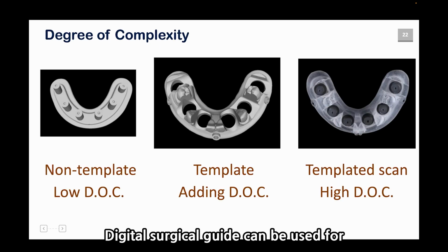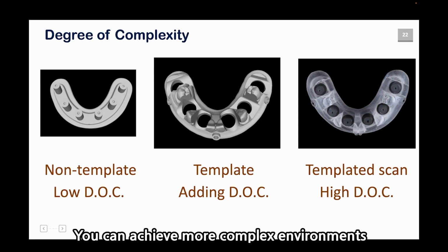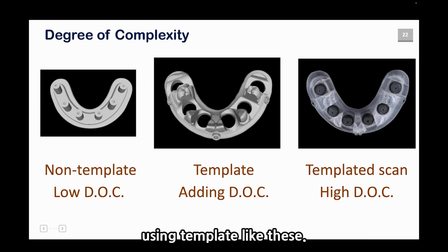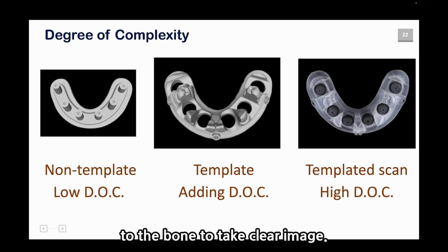Digital surgical guide can be used for not only surgery but also scan template. You can achieve more complex environment using template like this. But during the scan, you should fix template to the bone to take a clear image.